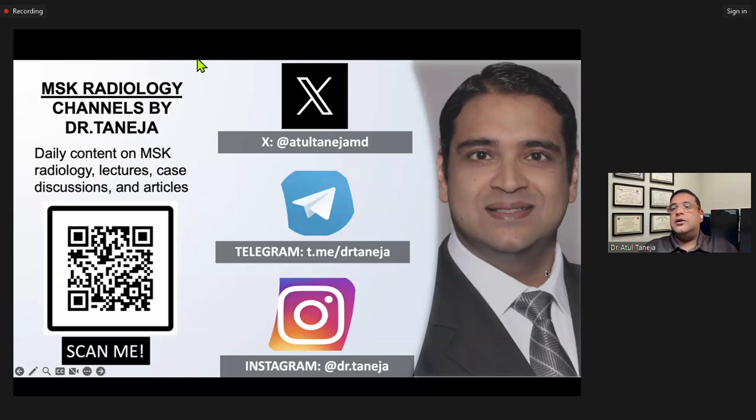No. You will see on ultrasound easily on type 4. I will not say about the other types, because on the other types there is not much displacement, not much gap. So usually it's type 4, which is the one where there is an anterior displacement of the meniscus. And still, ultrasound has very few studies on ramp lesions. We might see in the near future, but I'll leave that beautiful image I showed you for the type 4.